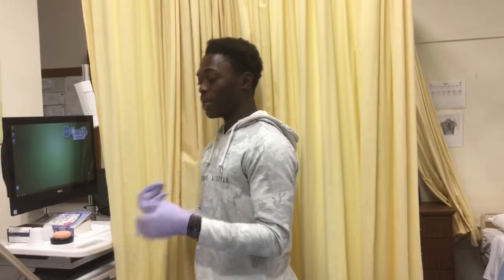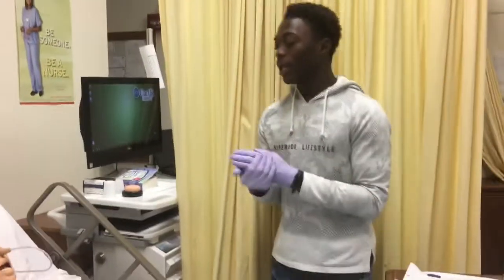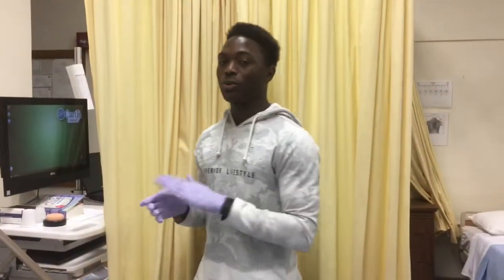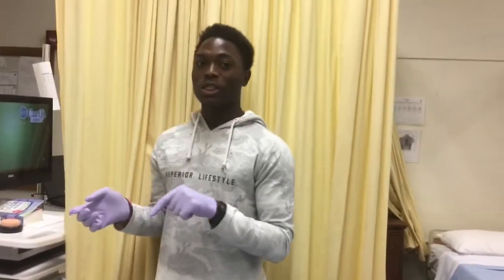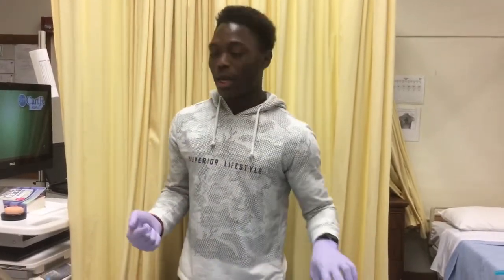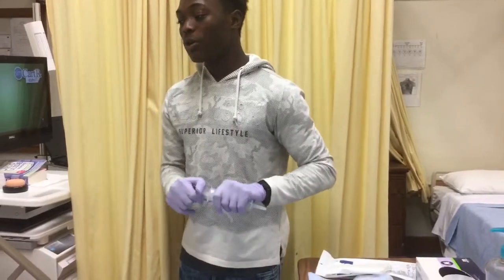I'm gonna apply the same standard procedures, identify my patient by name and date of birth, provide hand hygiene, and wear my gloves. Every time you come back to the room, you always want to check for placement of tubing, because the tube could be within the patient's trach or in the patient's lungs.